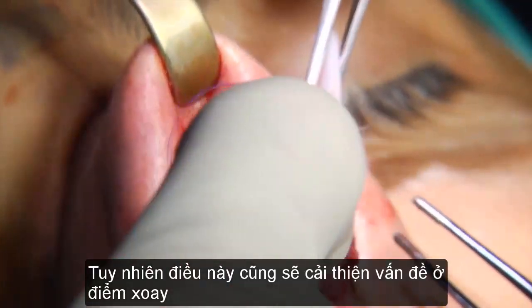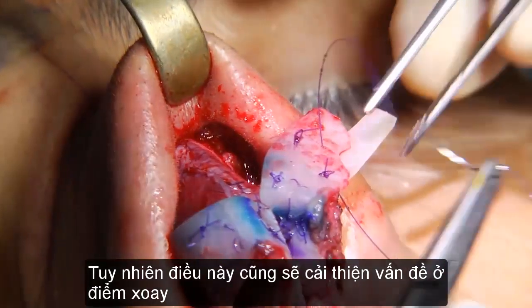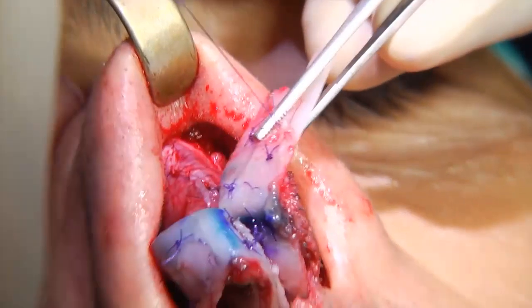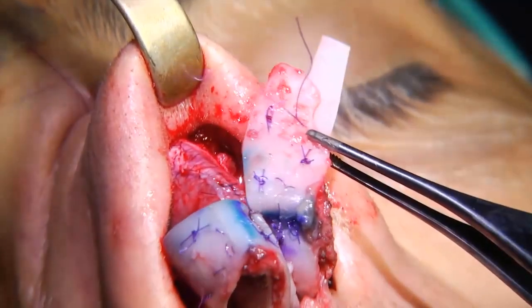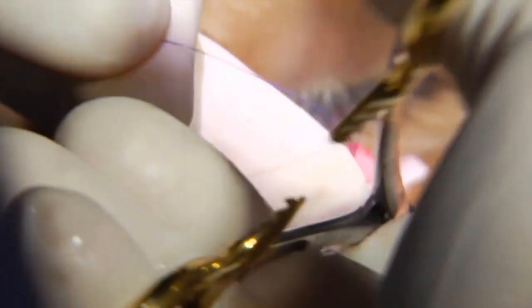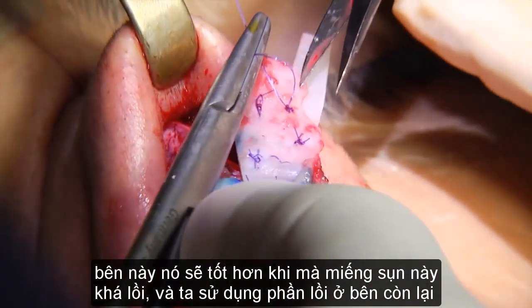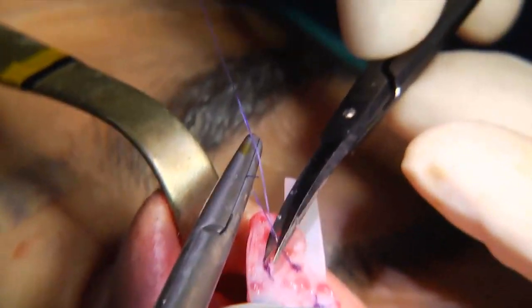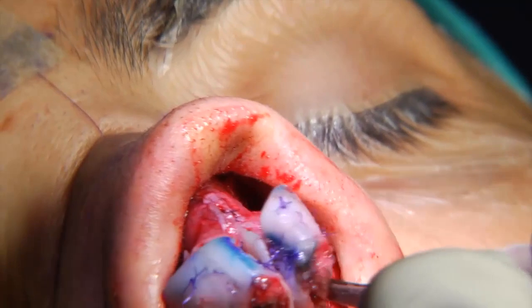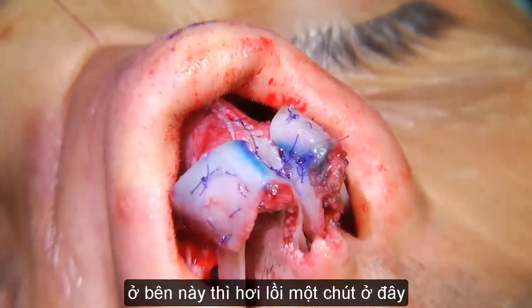So in a way this thing will also improve the turning point issues. He's a big nose. I want it supported well. So this is better than the other one since that thing was convex and I used the convexity on the other side. So this will go like this, and this is a little bit too convex still.